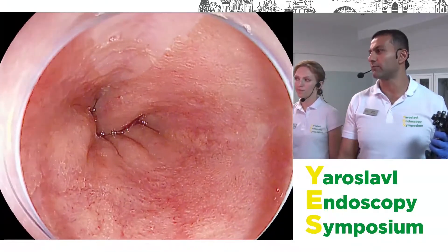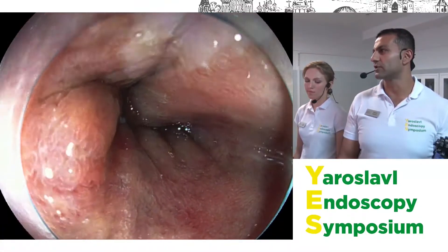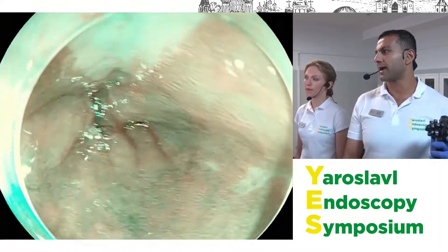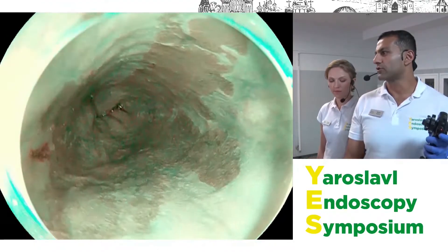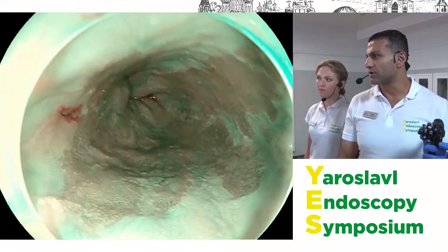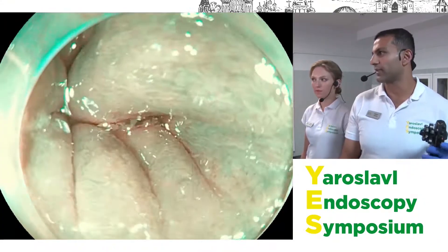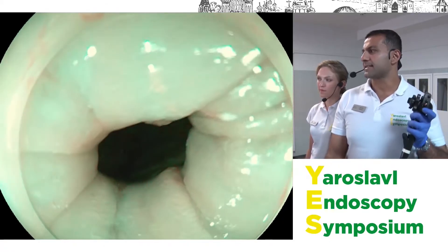The C classification is the circumferential amount of Barrett's. Using the optical enhancement here, there's really no circumferential Barrett's at all, so this would be C0. The M length is the maximum extent of the tongues of Barrett's. Pulling the endoscope back, the most proximal extent is at about 38 centimeters, with the top of the gastric folds at 41 centimeters — giving us a C0M3 segment of Barrett's esophagus.